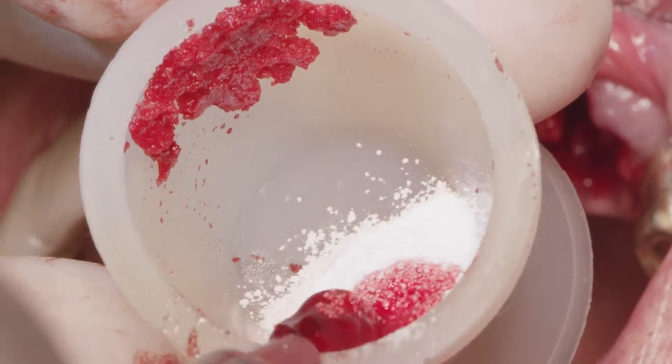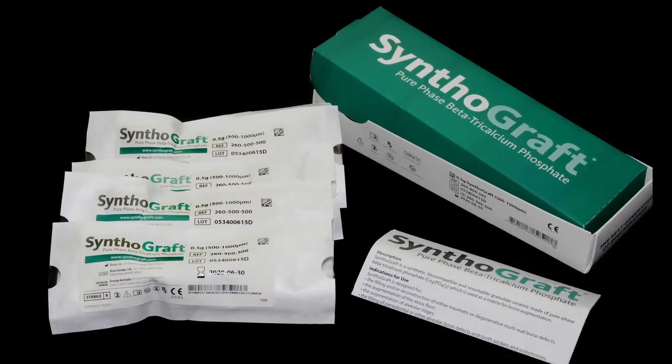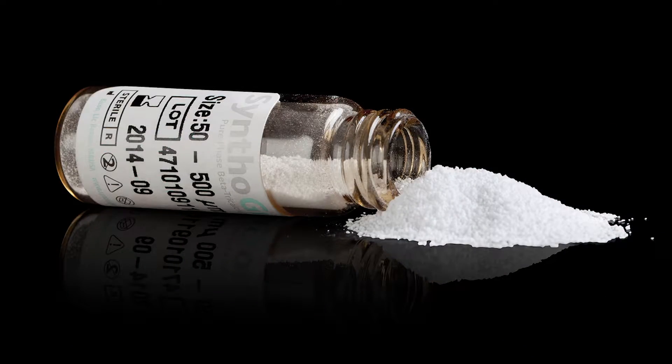If you harvest any bone during the osteotomy preparation, you may use that bone to fill the voids. If not, feel free to use any bone grafting material, like Sintagraft for example. The idea is to protect all areas of the implant and socket so they are not exposed.